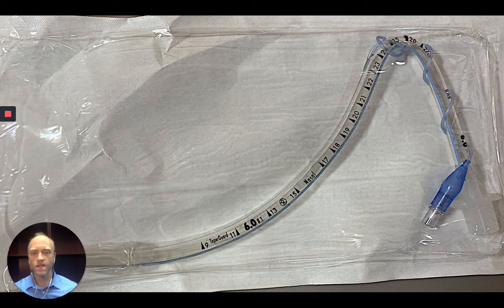So one safety consideration that I like to keep in mind is that small caliber endotracheal tubes are also shorter. So a 6.0 tube is shorter than an 8.0 tube. The standard 6.0 tube that we stock is 28 centimeters in length, and that should be long enough for the nasal approach in most people. However, if you have a particularly tall patient, it may not be.